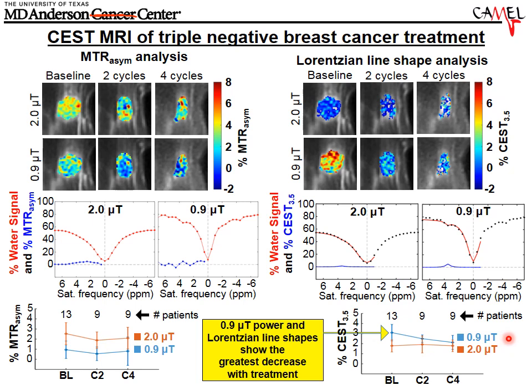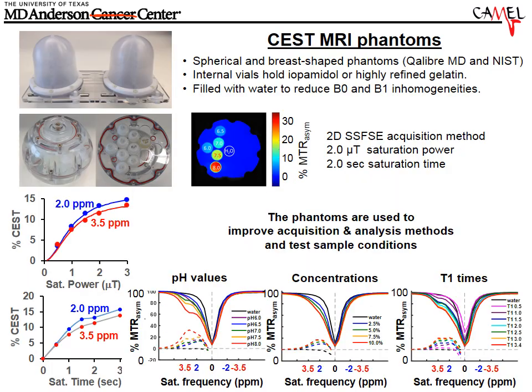So endogenous CEST MRI is really measuring protein content and is relatively insensitive to changes in pH, which are rather subtle, and it takes some expertise to really measure the pH of the tumor. It's relatively easy to look at the protein content, and I think that's a point that has been a source of confusion in the literature.